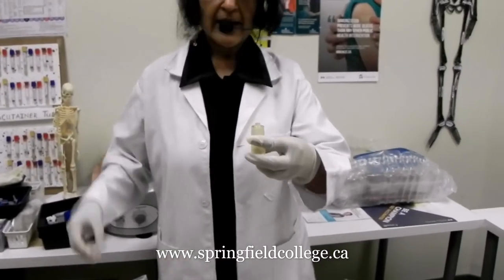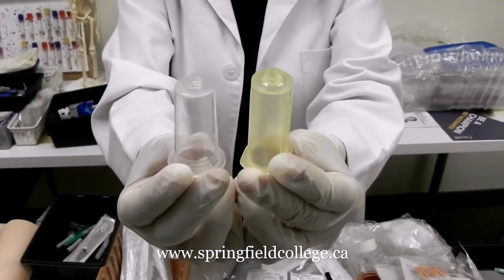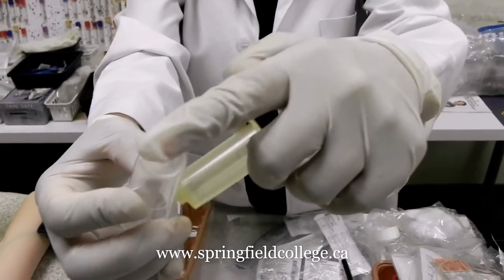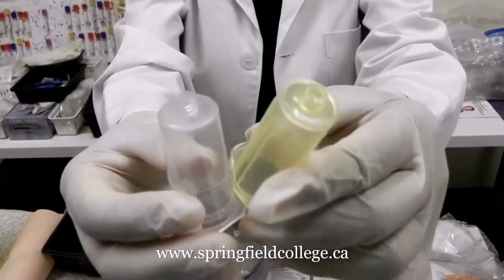First we have a look at the main commonly used technique, which is the vacutainer system. I am going to show you the component parts. These are the vacutainer system's components — the tube holder, also known as the needle holder. At one end it attaches the needle, and the other side goes the tube.